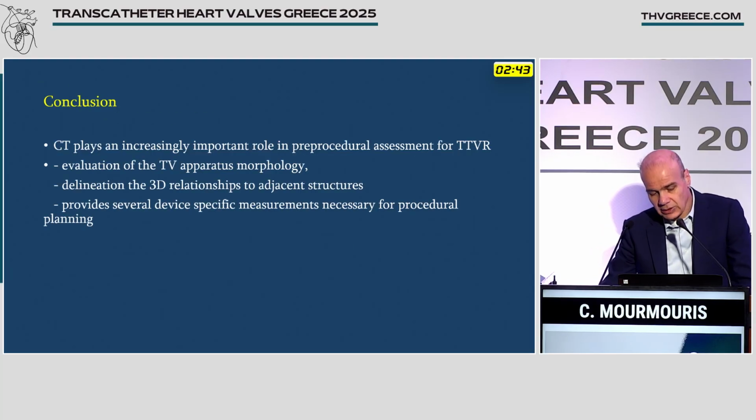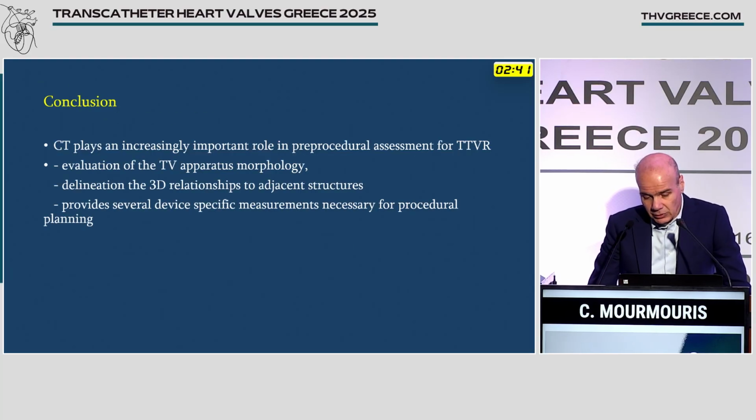So, in conclusion, CT plays an increasingly important role in pre-procedural assessment for this procedure by providing information for the TV apparatus morphology, by providing information regarding the 3D relationship to adjacent structures, and also providing device-specific measurements necessary for procedural planning. Thank you.